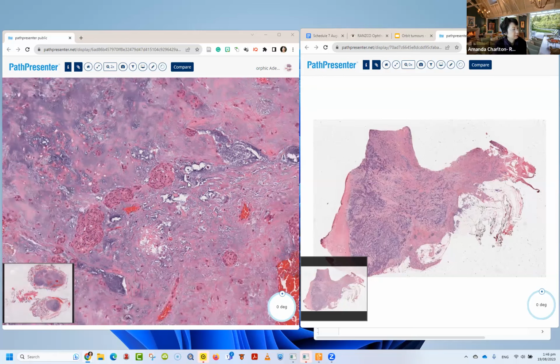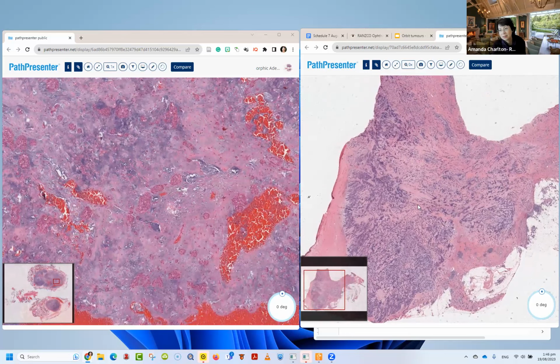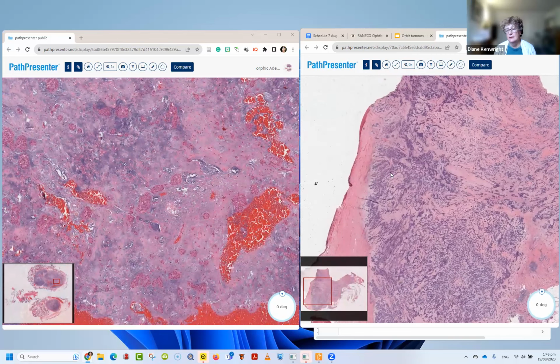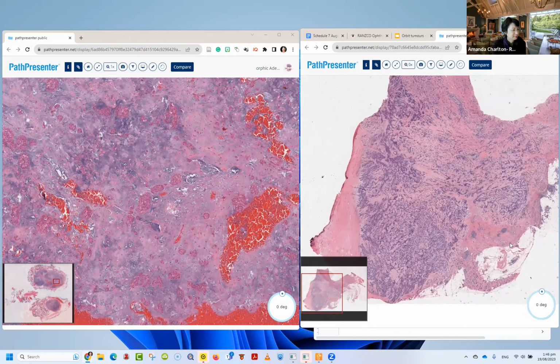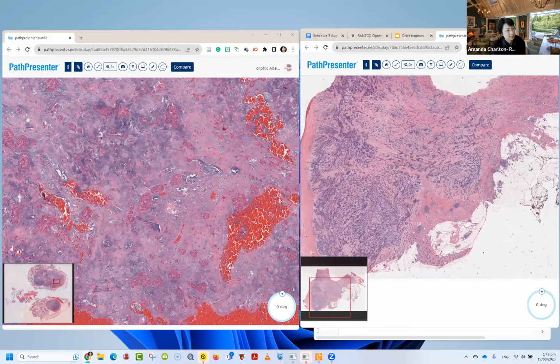Yeah, we should. Now, this was interesting about, first of all, determining the normal tissue type. We've got another very infiltrative tumor. Infiltrating, yeah. There's some fat, isn't there? Yep. And there's some ink on the fat.